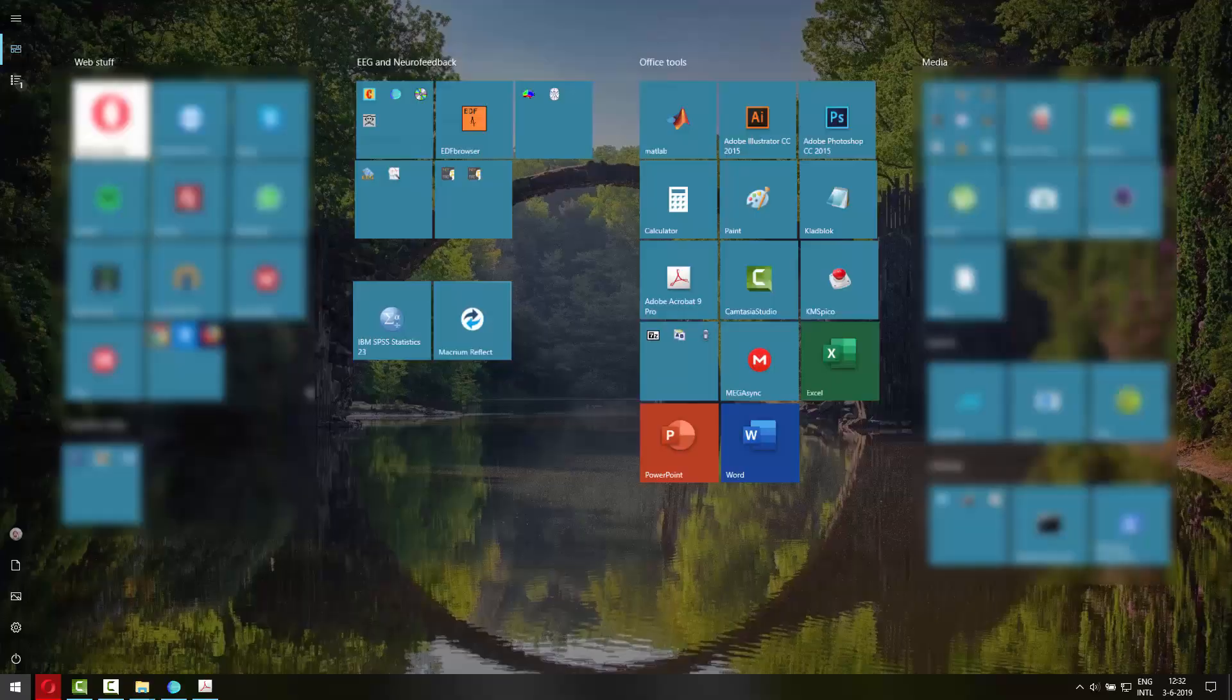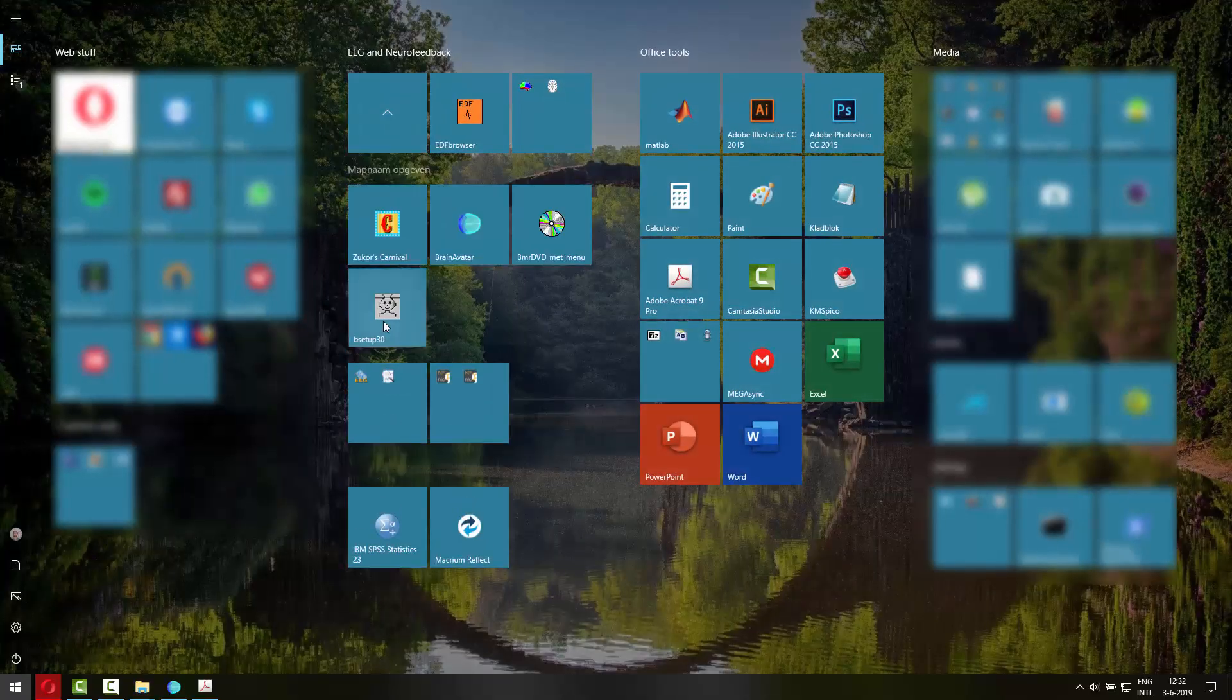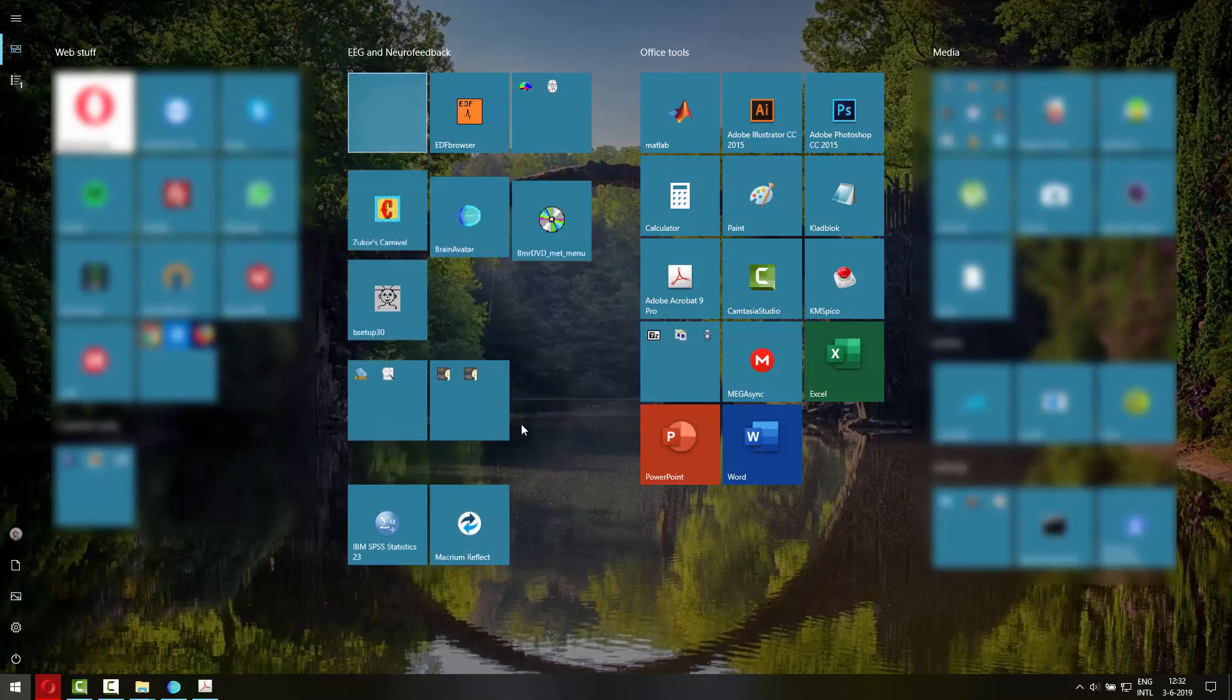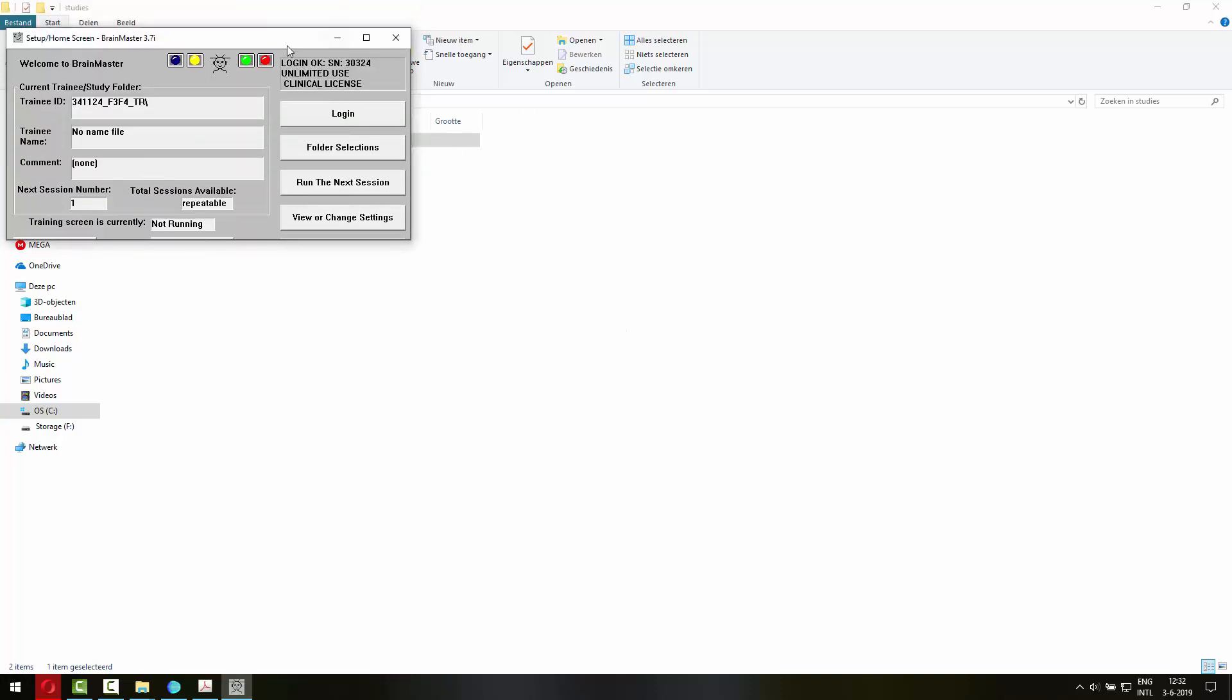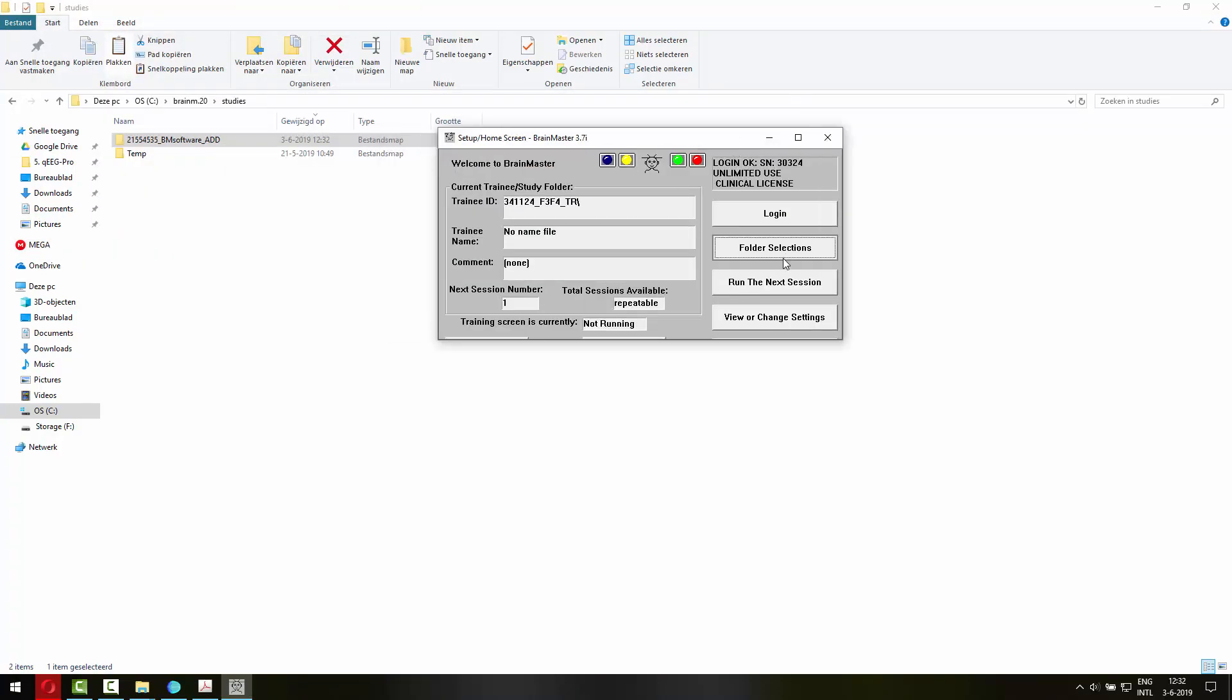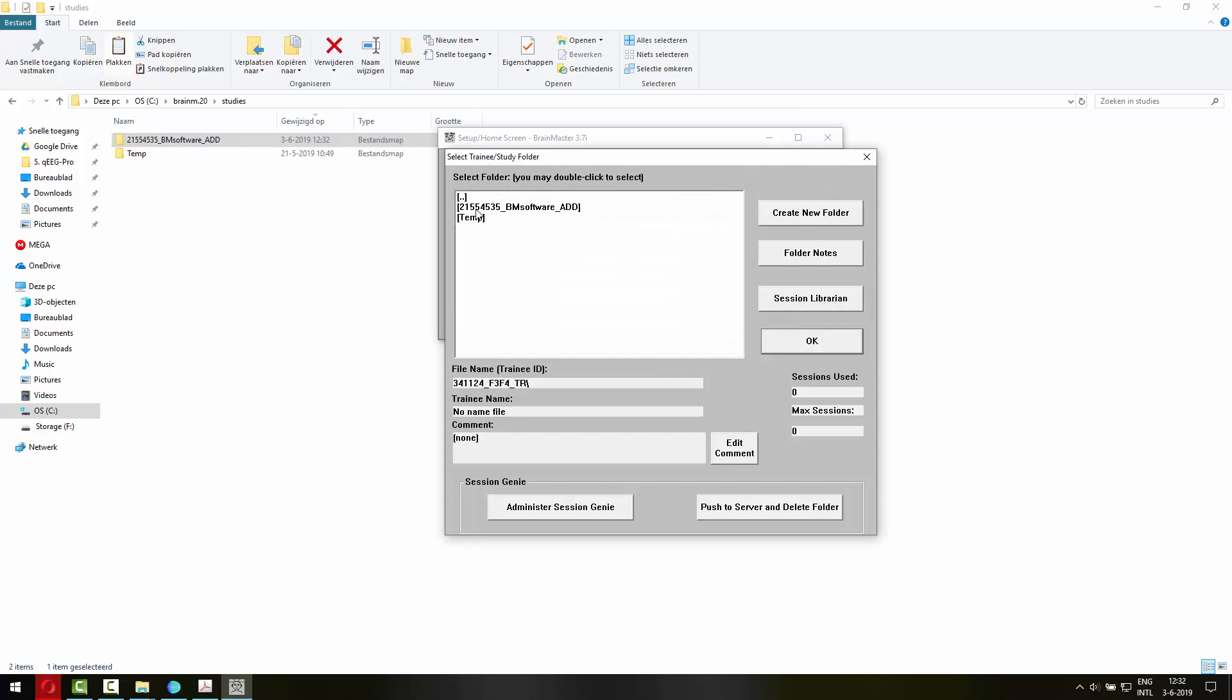Then in the Brain Master software, let's go to that program. You can now go to folder selections and here it is. The exact settings file that we've created with the protocol toolbox option in QEEG Pro.